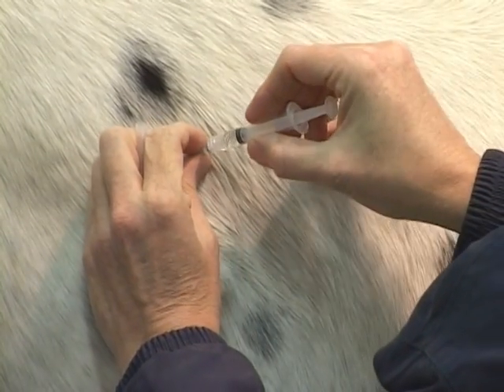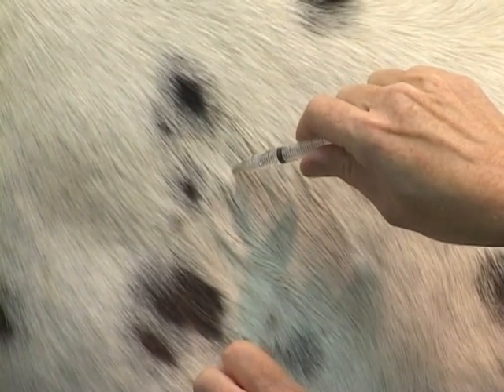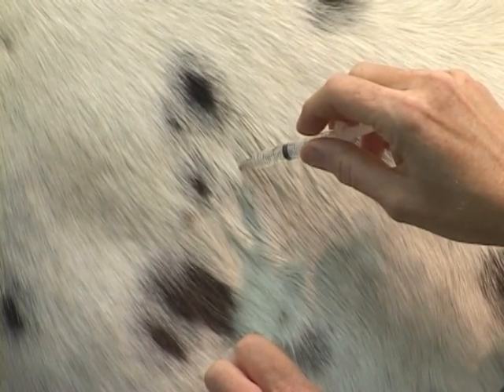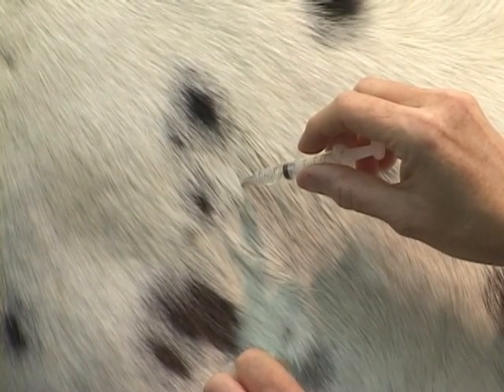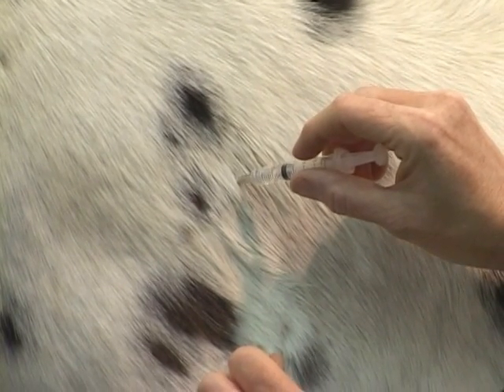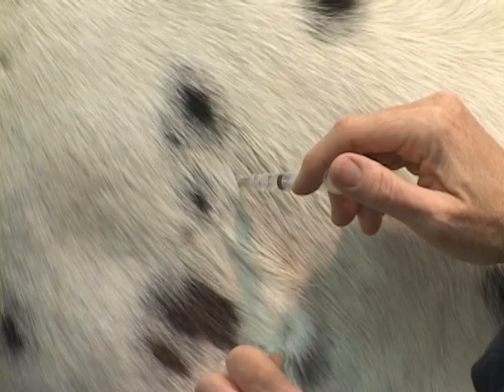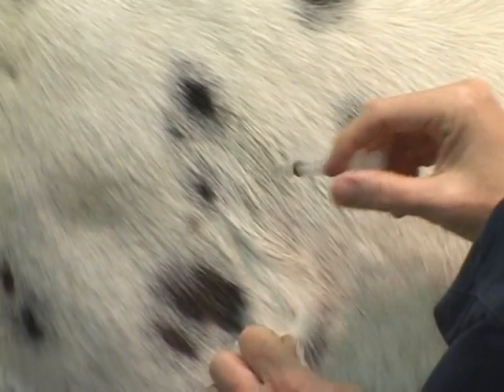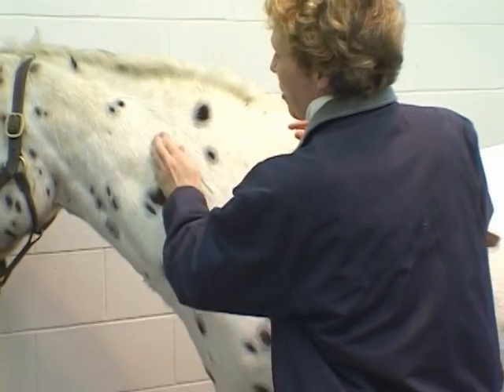I connect my needle to my syringe. Now here's an important part — I'd like everybody to remember to always draw back on your plunger, establish a little vacuum in there, and make sure that you haven't actually gone into a blood vessel. There are lots of injectables that, if they're designed to go intramuscularly, cannot go intravenously, and should you get them intravenously, will cause a reaction. So you have to discipline yourself to do that. When it's time to inject, I just inject — no big deal. Pull my needle and syringe out, and that's all there is to it.